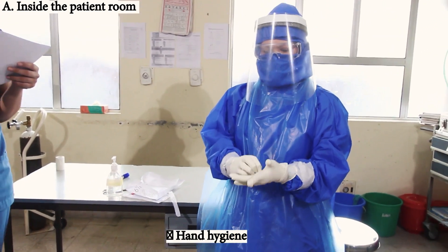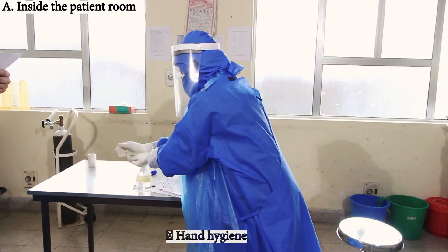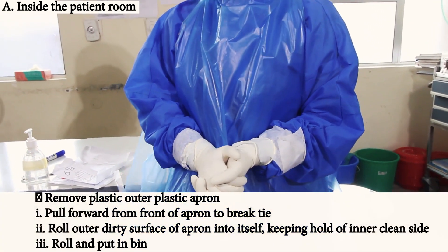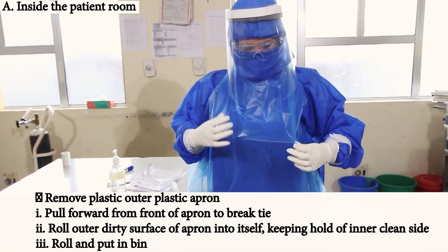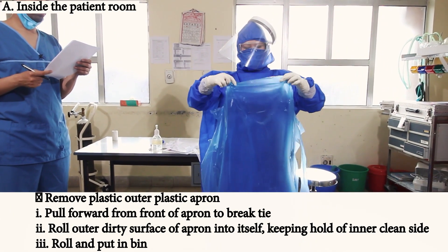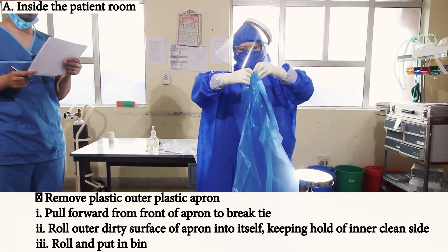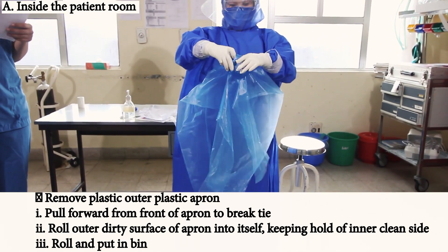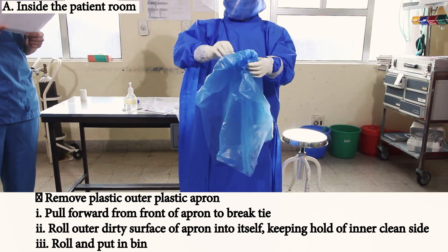Hand hygiene is performed. The outer plastic apron is removed. Pull forward from the front of the apron to break the tie. Roll the dirty surface of the apron onto itself, keeping hold of the inner clean side. Roll it up and put it in the bin.